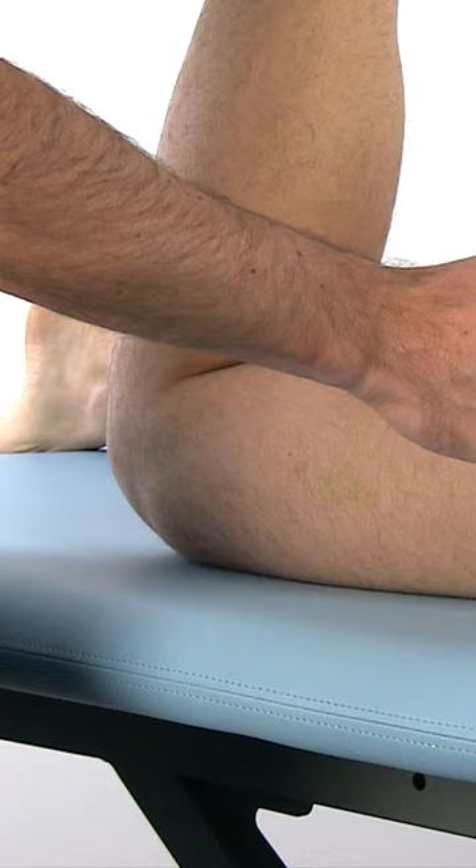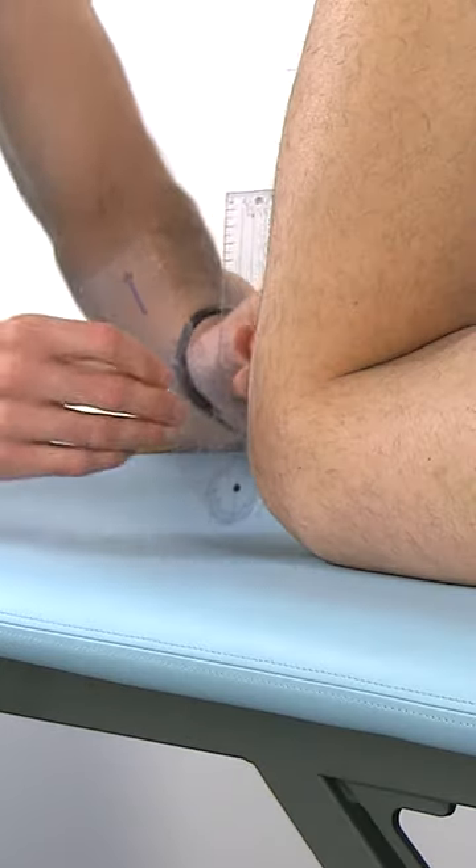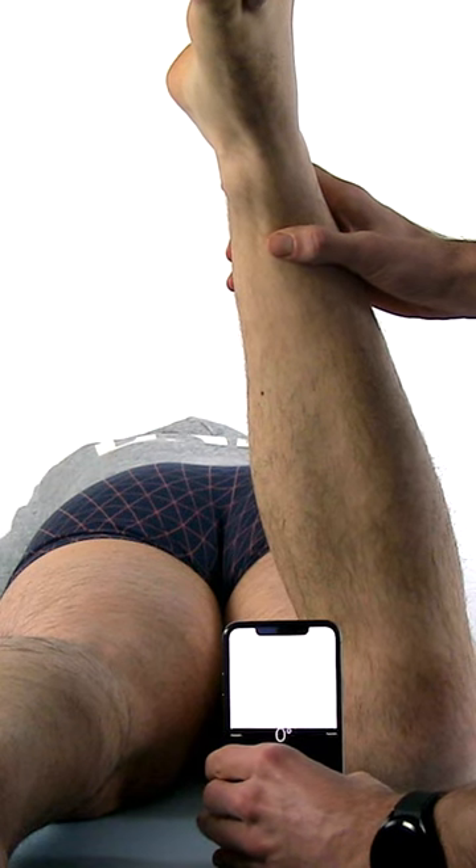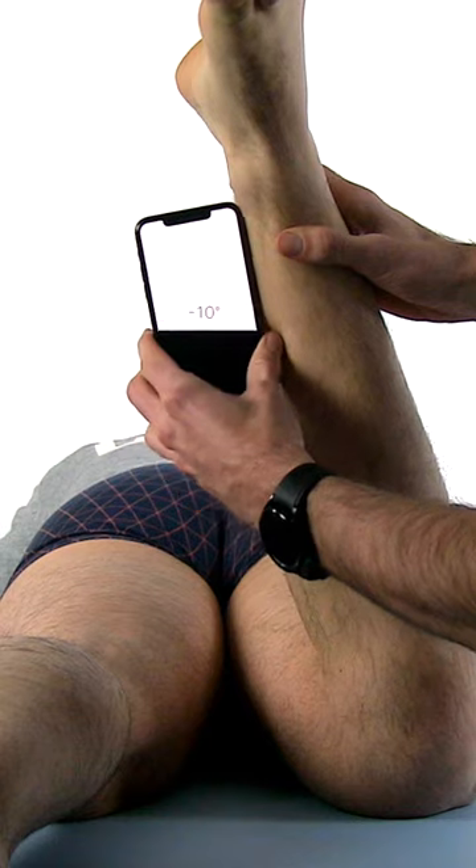In this position, the examiner uses a goniometer to measure the degrees of anteversion or retroversion in relation to the position that is perpendicular to the table.